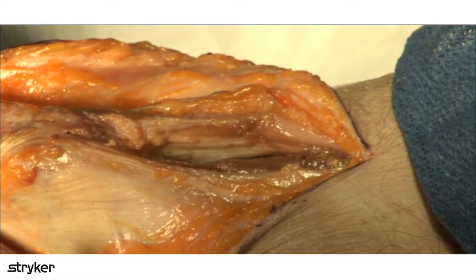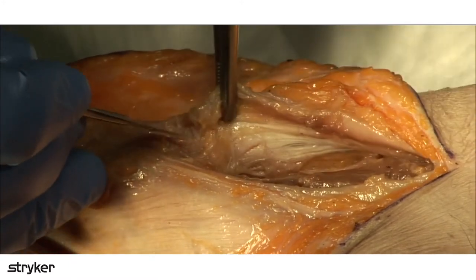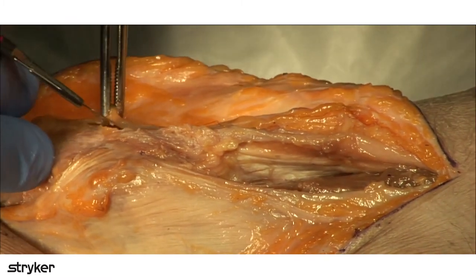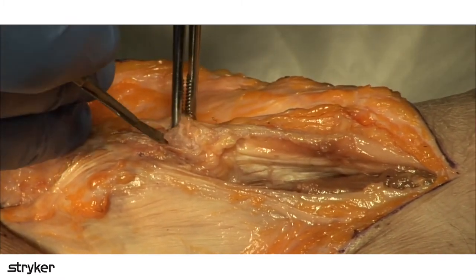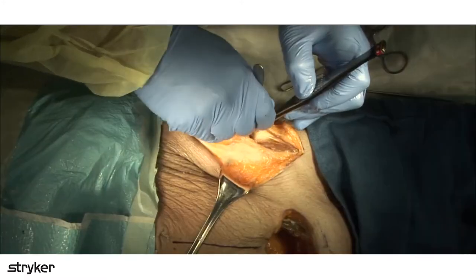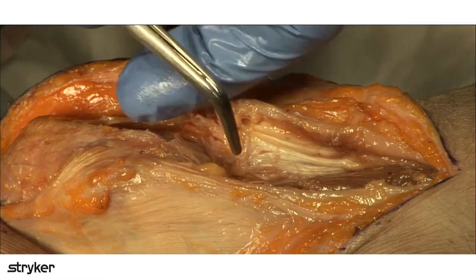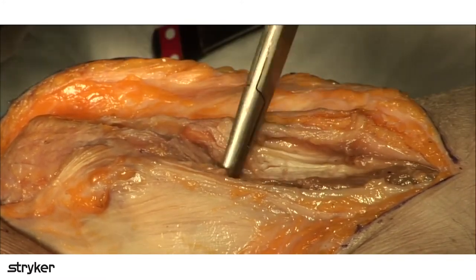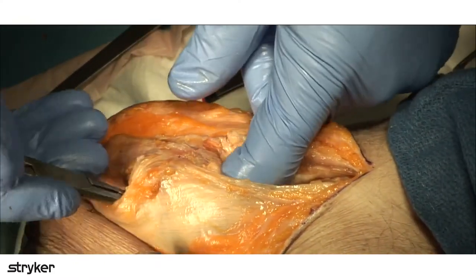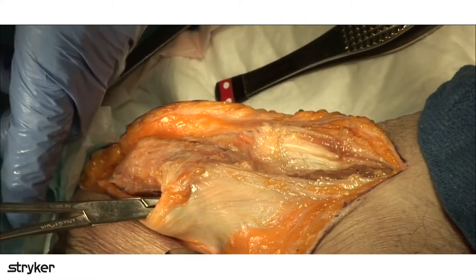And then you take your soft tissue dissection off laterally a little bit more from here proximally, down along here distally. What it'll let you do is get into the interspinous notch, which you can feel with your finger. It's very easy to feel right in here. You can see it. You can pass a clamp through there, and that gives you the point that you want to aim your osteotomy at.